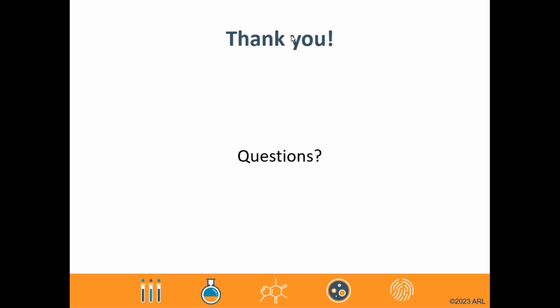There's a question here: how does the FDA view rapid sterility methods utilized in CGMP environments in lieu of USP 71? I can speak to the first part of that. Brian may have a little bit of additional information. As I mentioned in the presentation, the FDA is open to reviewing and approving method validation protocols using rapid sterility testing techniques. They just haven't blanketly accepted any one technique over the others that are available. I think the primary reason for that, again, is the differences that labs or different product formulations may have when they're interacting with different methods.